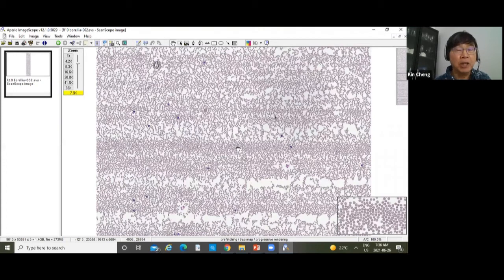Now, I hope that your lab has an SOP telling you how to scan a slide. Because most people will say, "Oh, I know how to scan a slide," and then lots of technologists will say, "Okay, this slide requires the differential." So they immediately put the slide under the microscope, go right up to 100 power, finish the differential within 1 or 2 minutes, and then move on to the next slide. That is totally wrong. This slide will illustrate to you why it is important to scan the slide. Now, in this scanning, you're at low power.